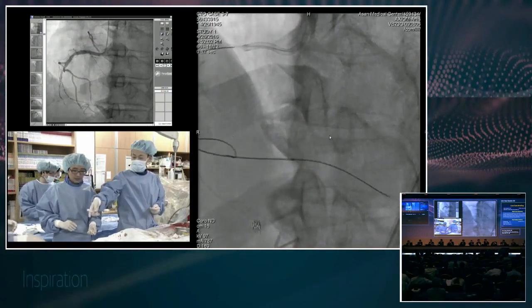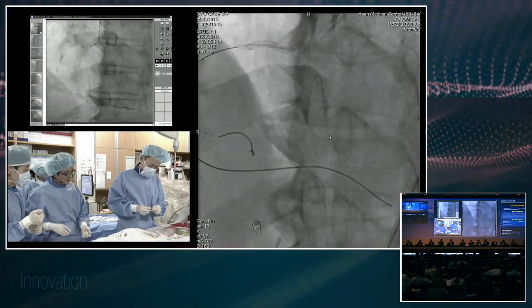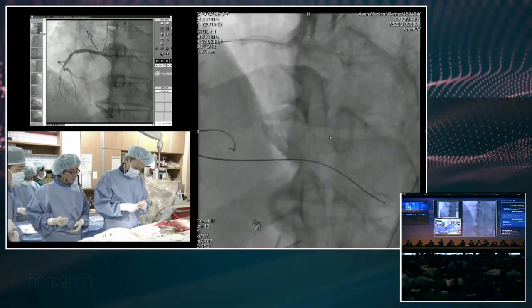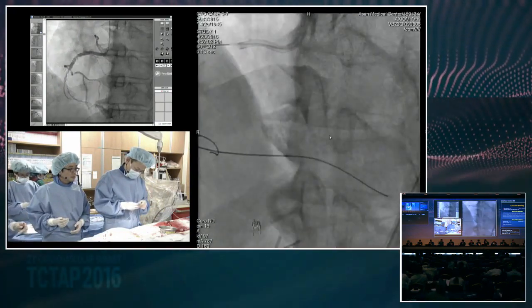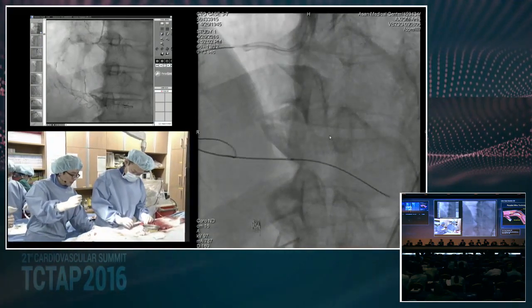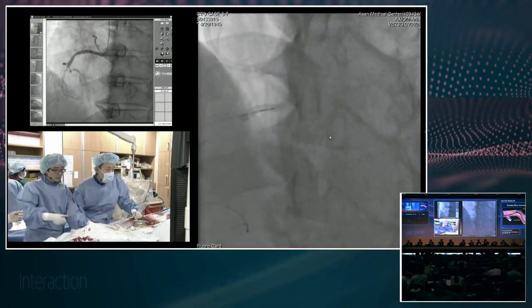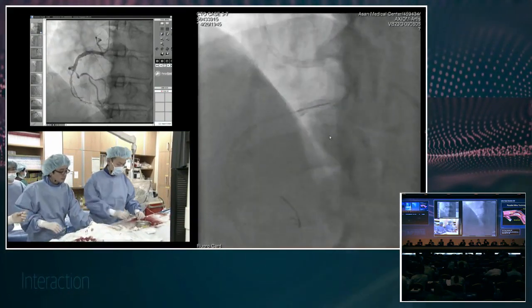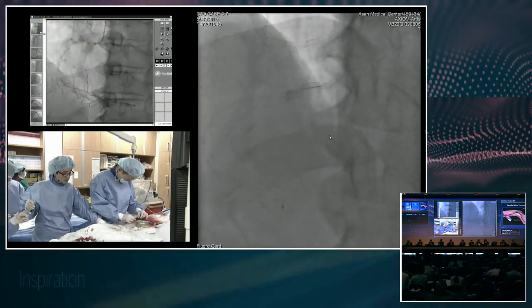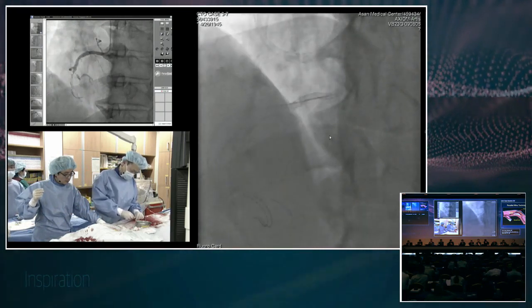Could you connect the 1.2 by 6 millimeter? These days we have very good 1.0 balloons, including the LUX 1.0 by 5 millimeter, or even from Korean companies, several 1.0 balloons. I heard about the 0.75 balloon. Yes, slender. Not only the slenderness, the shaft support must be important to push.